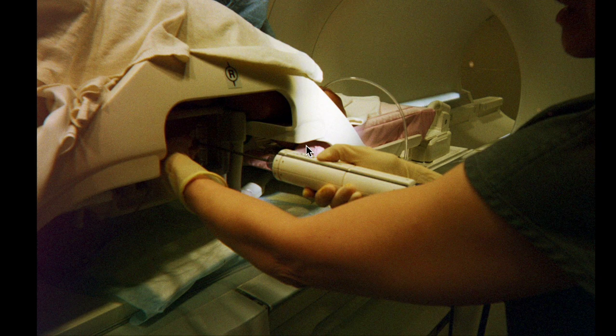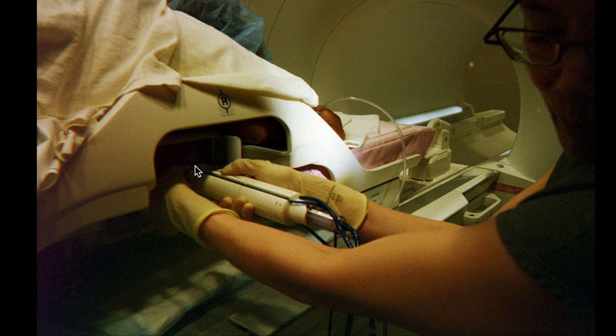I also want to let you know how to control the sample taking. In order to take the samples, I put my foot on this foot pedal and hold it down, and at the same time, I'm turning this. I put my foot on there the whole time, so the sample taking probably takes about 30 seconds. I'm holding my foot down for 30 seconds and turning this. You're going to hear a sound like bzzz. That's a sample being taken. Then I turn this to 2 o'clock, and I hear bzzz. And I turn it to 4 o'clock in between the buzzing sounds.